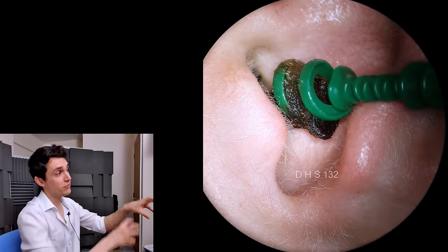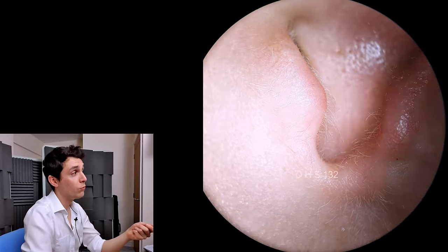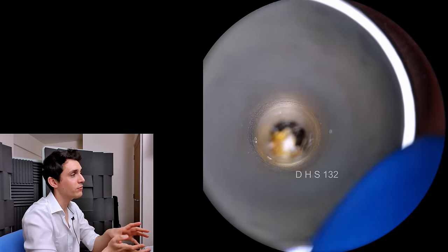So that's not the main culprit, that's just the front end. Now by pulling on this front end, what we've done is we've pulled the deeper wax forward, which is often the case.